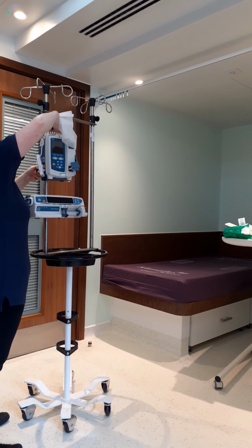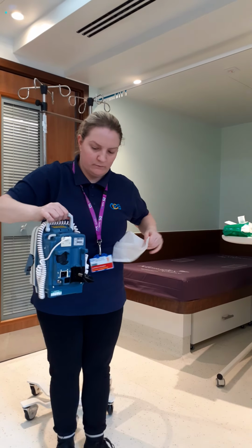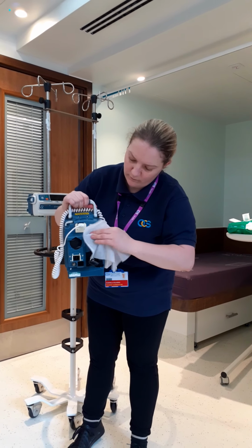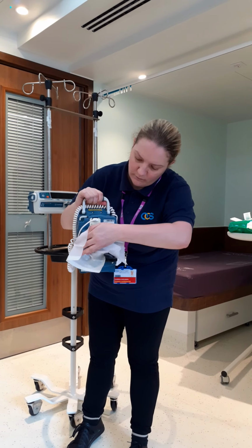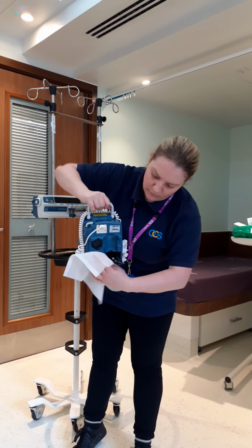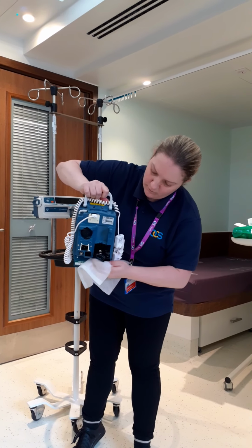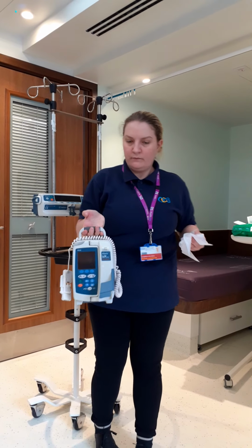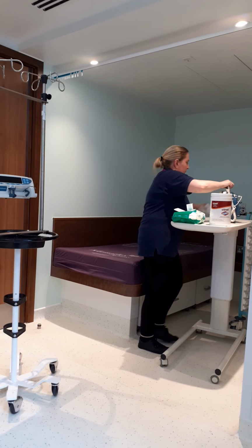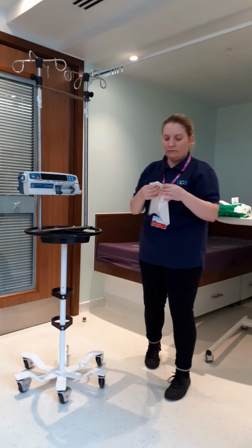Now we're in a position where we've cleaned as much of it as we can whilst it's attached. We need to remove it, making sure that we're only placing areas that have been cleaned onto new clean surfaces. You may need to put the objects onto a surface in order to be able to get enough pressure through the wipe in order to be accurately able to clean. But this is a decision based on what object you're cleaning. And now it's fully cleaned, we can put it on a pre-clean trolley, so we're making sure that no contamination of that piece of equipment is occurring.